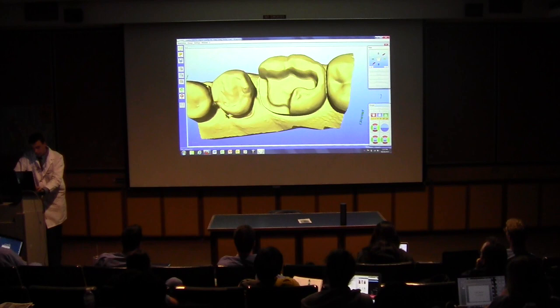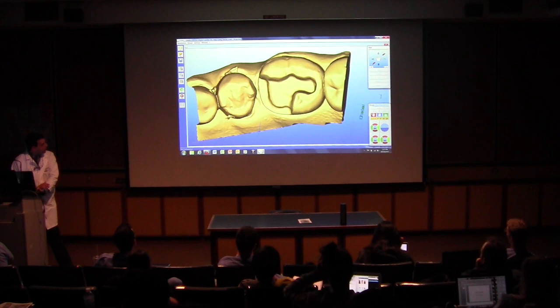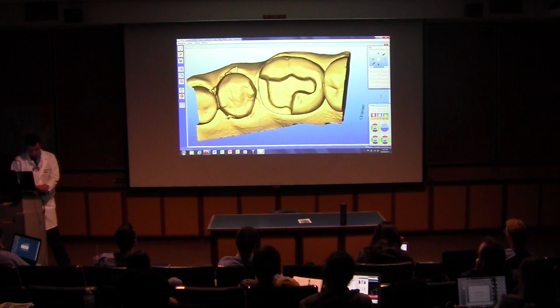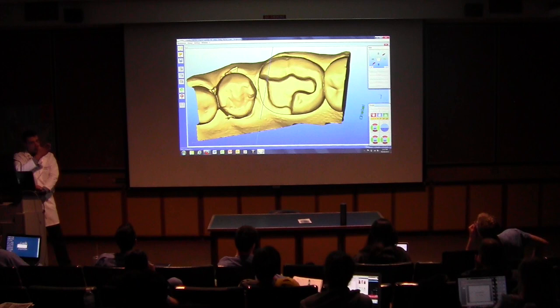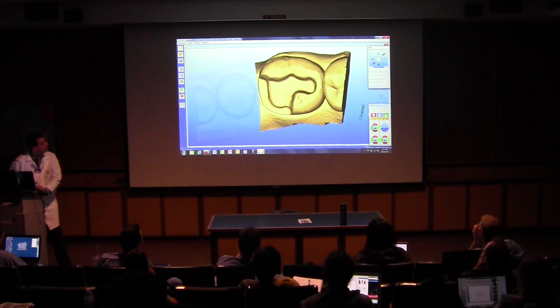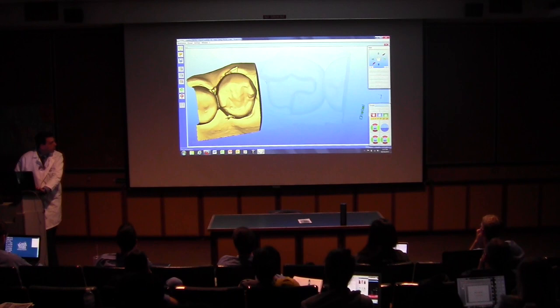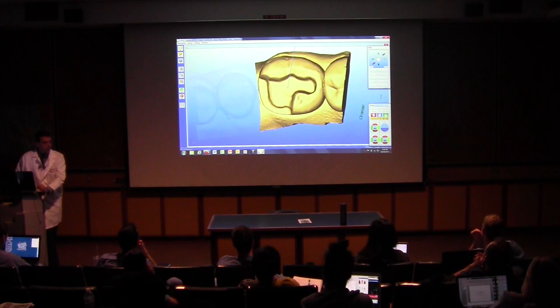So what you're going to do is just follow the software's rules here. Train the prep. You're going to put the cursor right between the teeth. Double left click. You see that blue line following my cursor. Now I have a green line on the bottom and a blue line on the top, and I can just contour the proximal area. Once I reach the other side, double click again. Guess what? Now I have this ghost image on the adjacent tooth. If by any chance you have the adjacent tooth highlighted and the prep tooth ghosted, don't worry, just double left click on your prep. That's it. Why do you need to train the adjacent teeth?